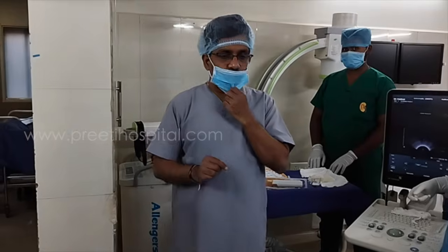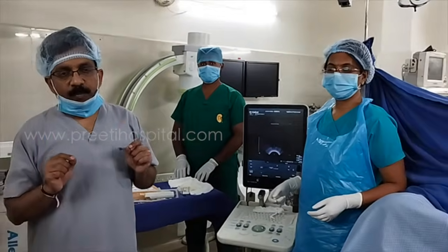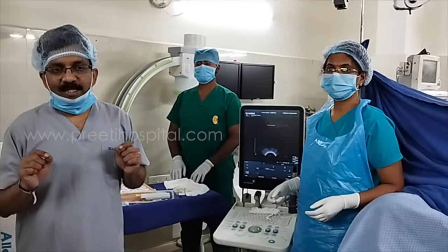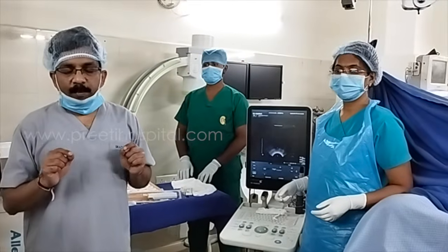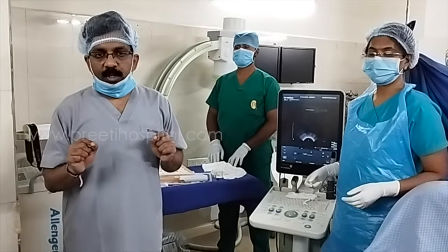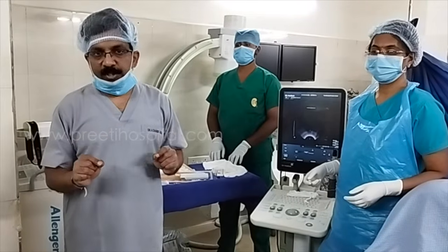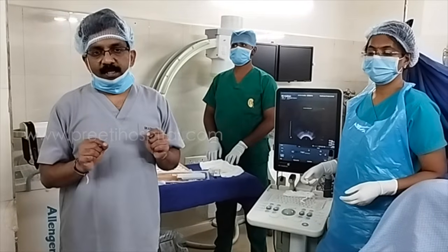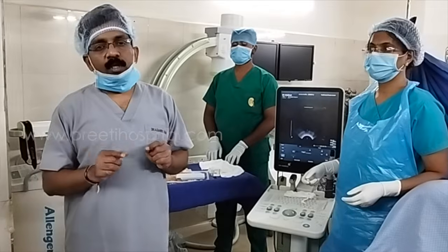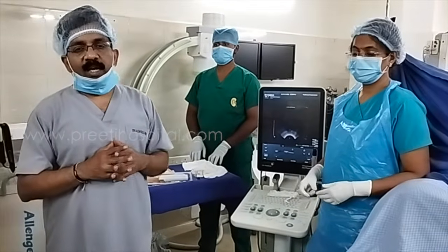Today we are explaining the transrectal biopsy of the prostate for raised PSA. The MRI report shows a right side peripheral zone nodule present at the base as well as the mid prostate region. PSA is 34. Dr. Soundarya has been doing this for the last 1 year.